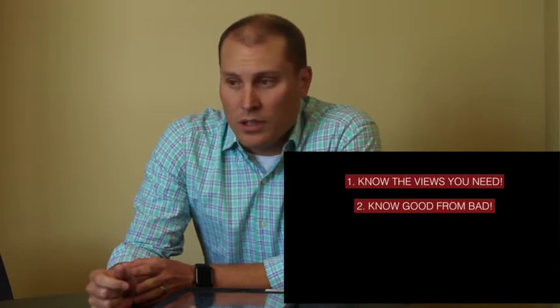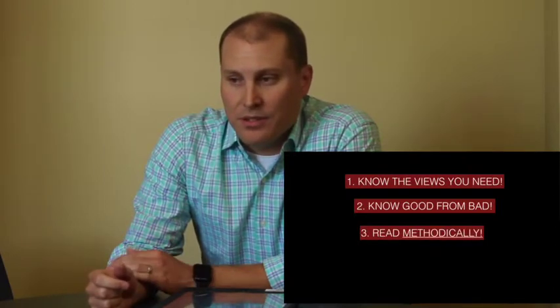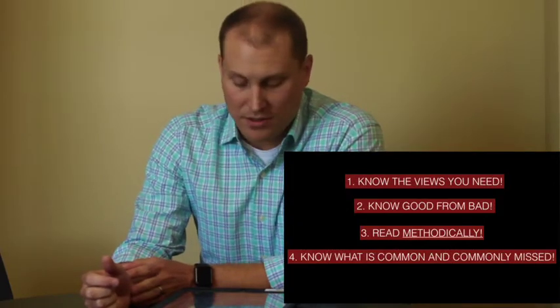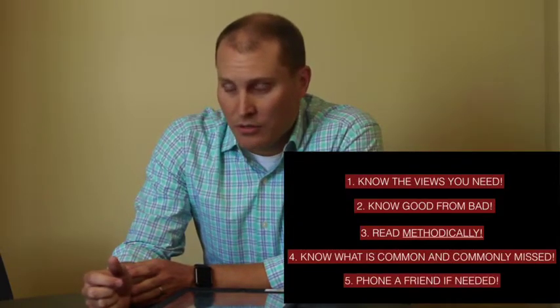But to start, the rules for success with any x-ray is to know which views you need, know good images from bad ones, read methodically, know the common lesions, and also know the commonly missed lesions. And when in doubt, you can phone a friend and call the radiologist if available.